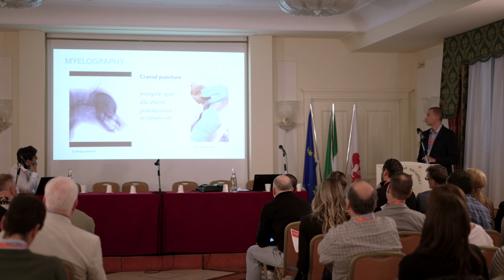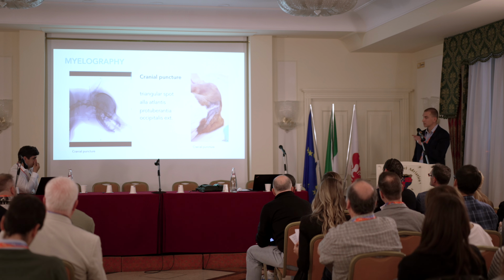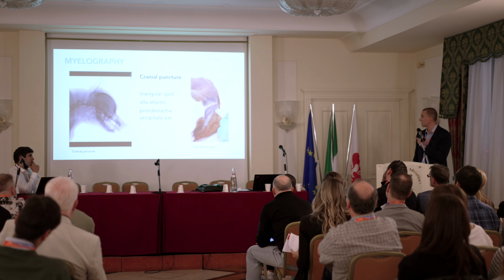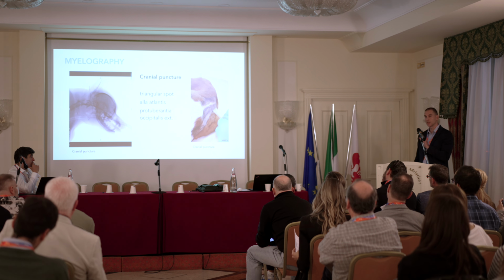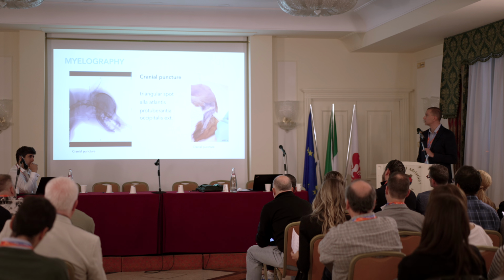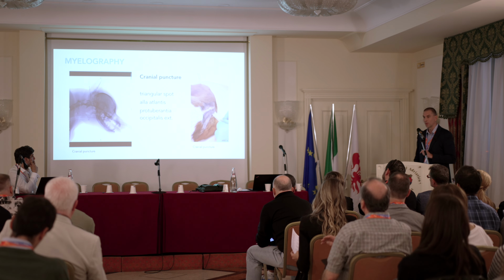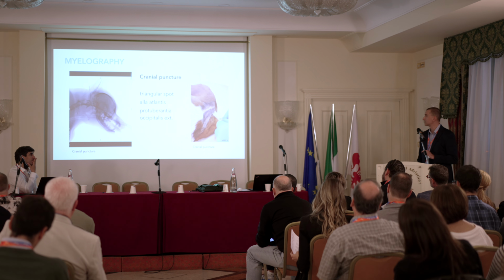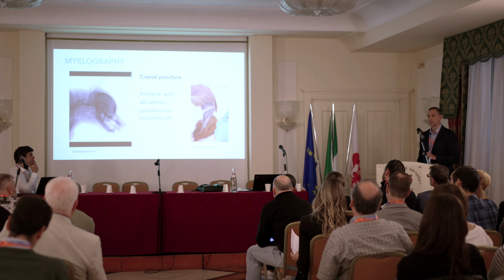So you can see that I just go through the skin and the muscles, touch the bone, and there is a time to be very patient, and your movement of the needle should be very, very delicate, but it's not a problem to go in. For all cases, I collect CSF.